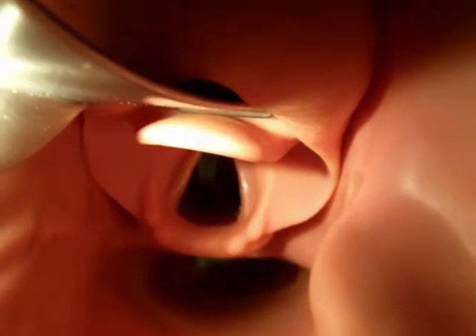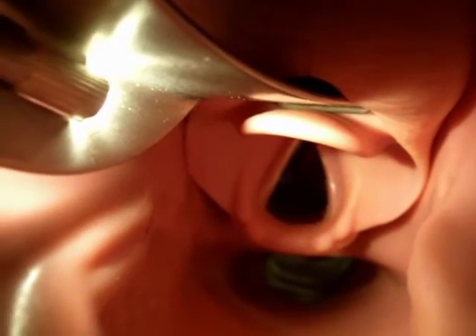With the curved blade, advance while identifying structures until the tip of the blade is in the vallecula. Then lift the handle to expose the glottis.